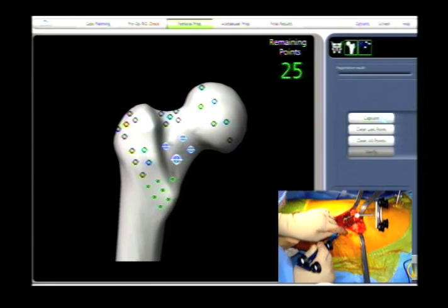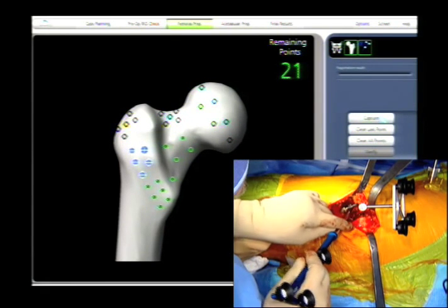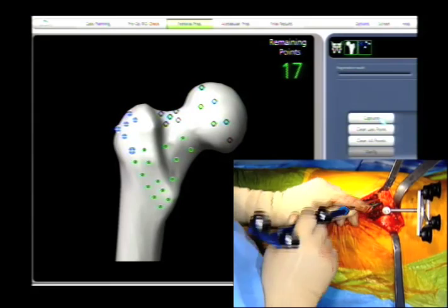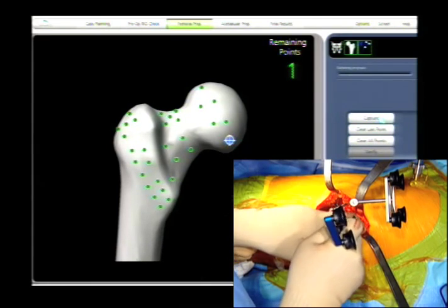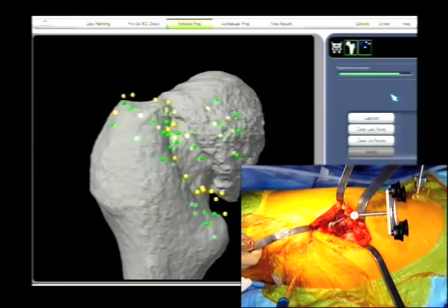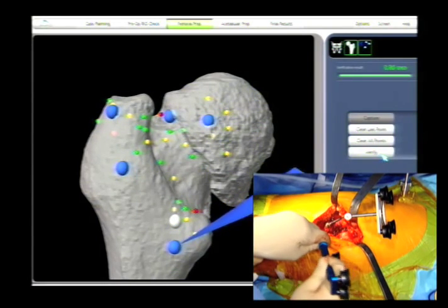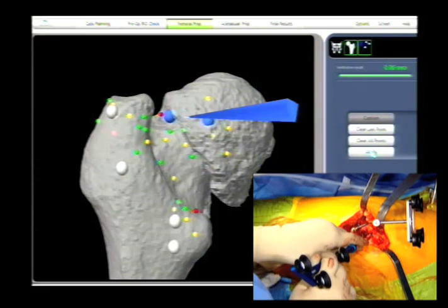He touches all these points and as he does that, it moves right into the computer — melding the actual patient anatomy with the CT scan within the MAKO robotic assist arm. That's about one minute for full registration. The computer reads all the numbers — you see all green and no red, meaning it accepts the registration. There are two reds, one at the saddle and one by the lesser trochanter. He then touches blues and turns them white, giving the outline of the actual femur anatomy.